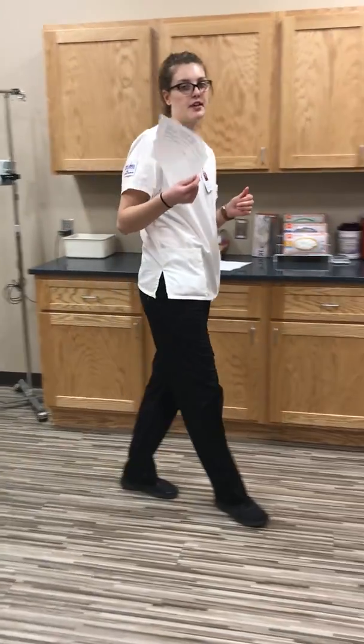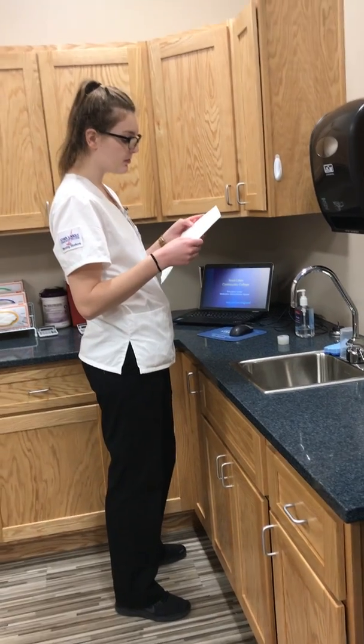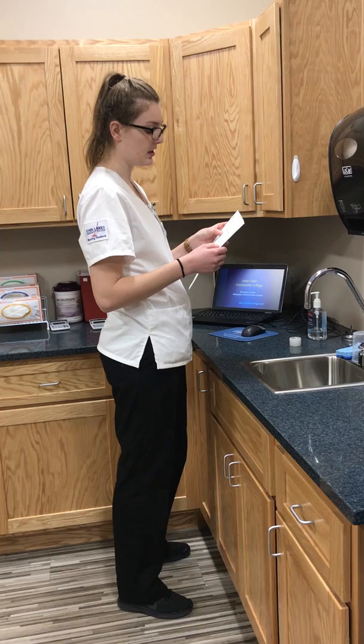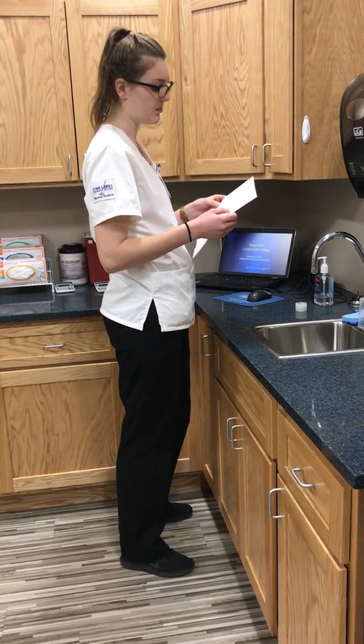So today I'm going to demonstrate how to do an ID injection. The first thing I'm going to do is look at my orders. And it does tell me that I need to administer a PPD test, a purified protein derivative. So this will test to see if he's been exposed to TB.